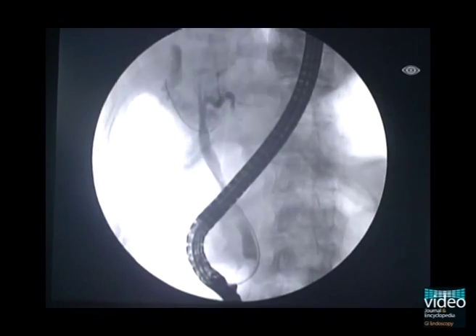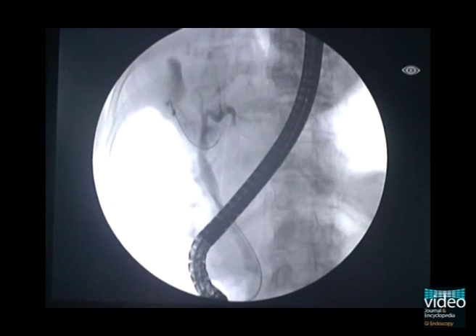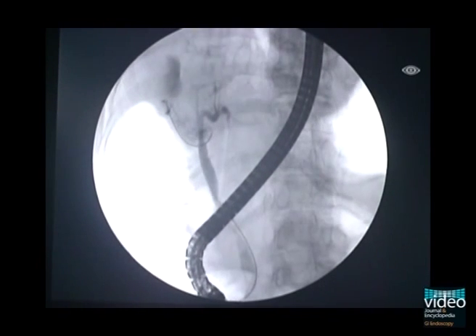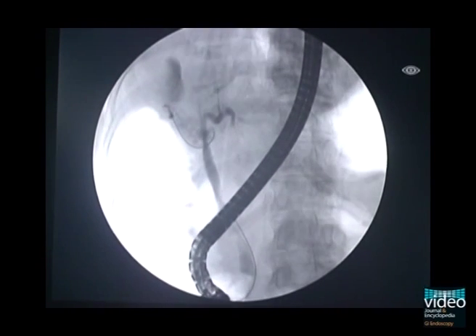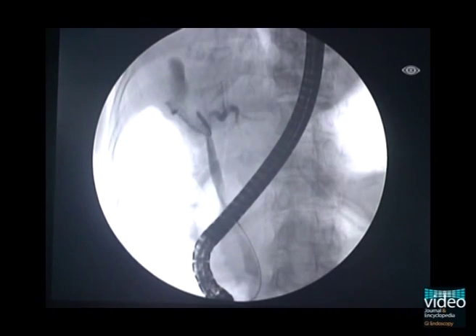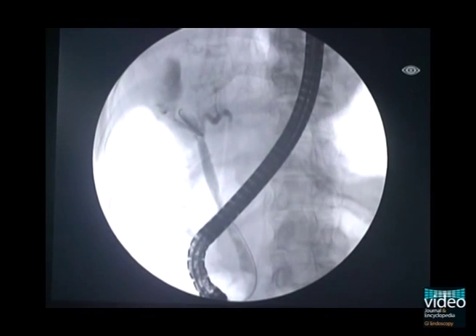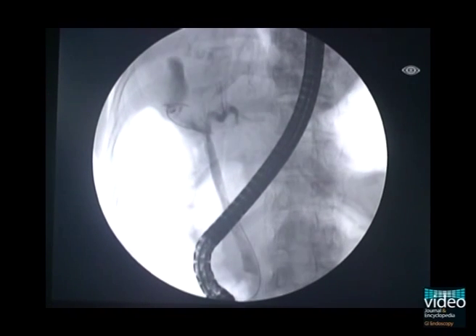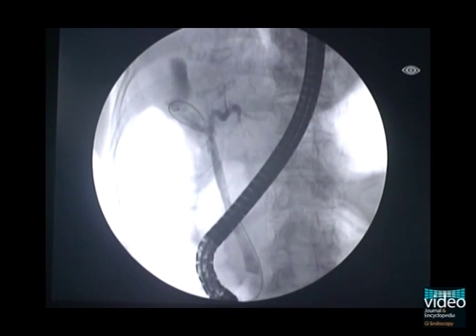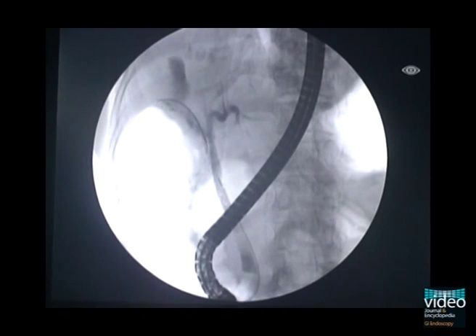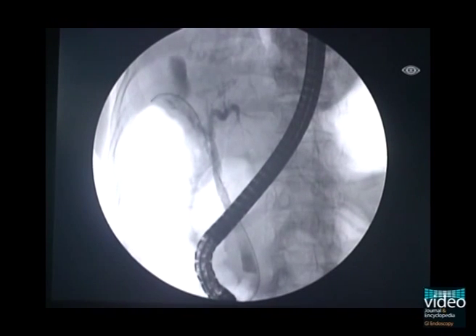Nevertheless, cystic duct negotiation is sometimes difficult in cases of cystic duct-impacted stones or severe inflammatory obstruction. Repeated excessive manipulation of the guidewire may cause cystic duct injury.